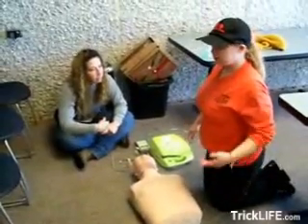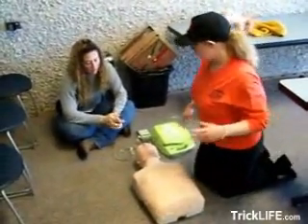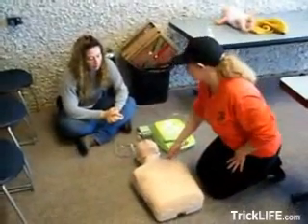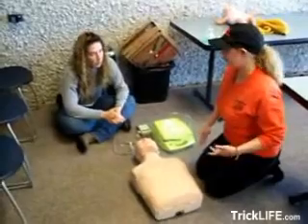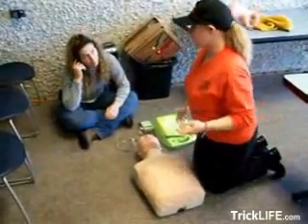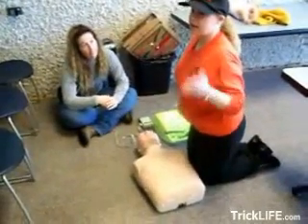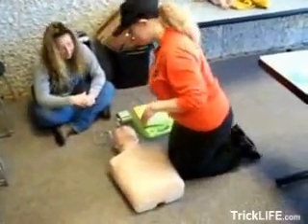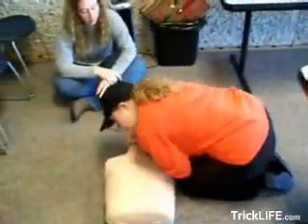We're in an office building. Don't holler for help right away — first check if she's responsive. If she responds, you're okay. If she doesn't respond, then holler for help: 'I need help!' Remington comes up and says, 'What do you need?' Tell him: 'I need you to call 911 and get an AED.' He's on his way, and while he's doing that, I'm going to check her.